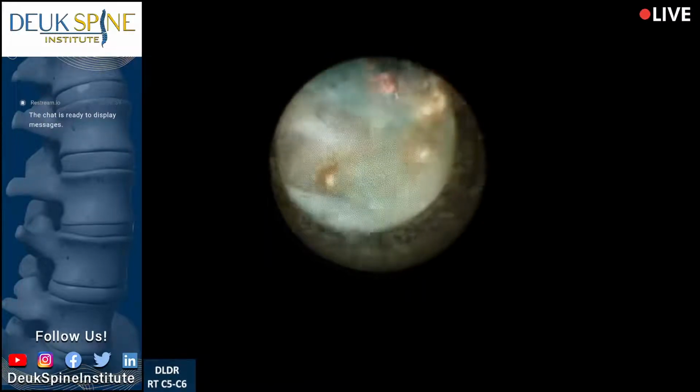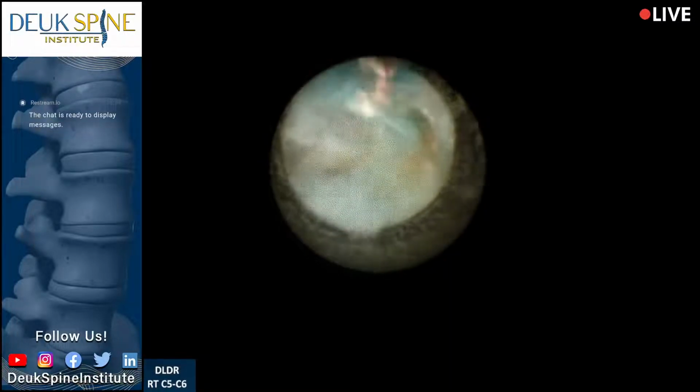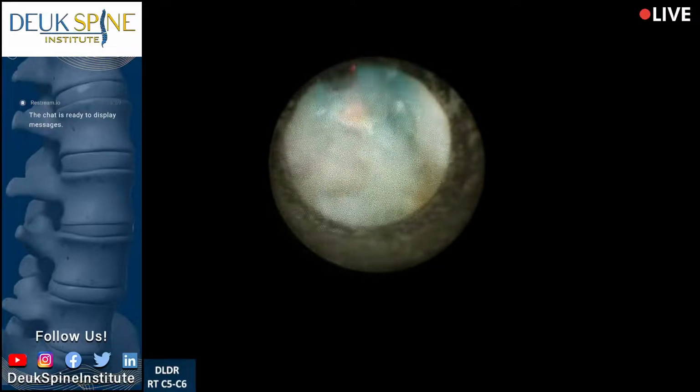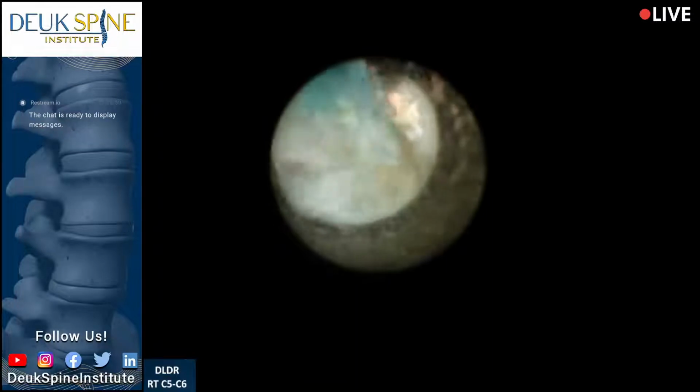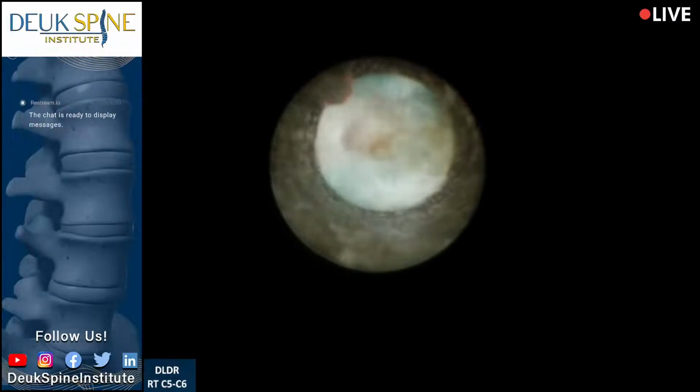This is the back of the disc where the herniation is. And I'm removing parts of the herniation right here. You can see the herniated disc is the blue stuff. This is not going to take too long, Dr. Berndes, I don't think. I think it's going to be a relatively quick one.